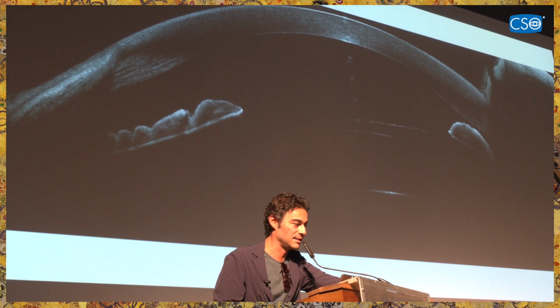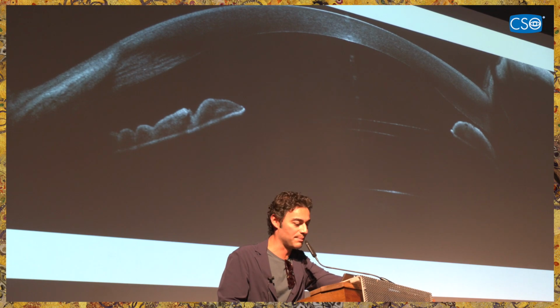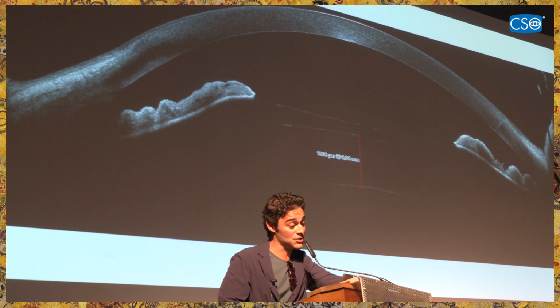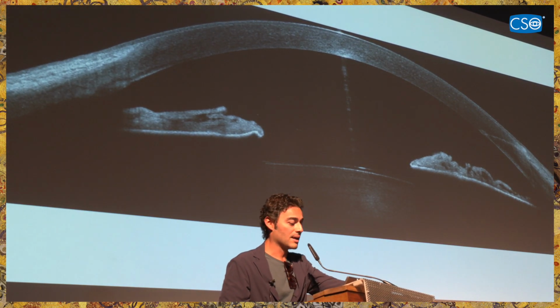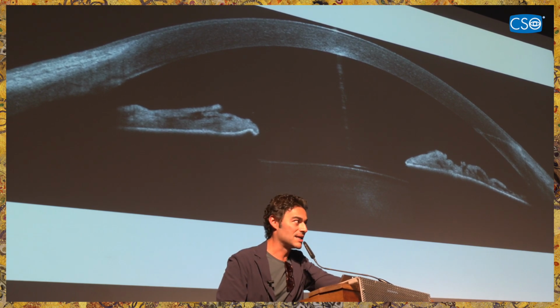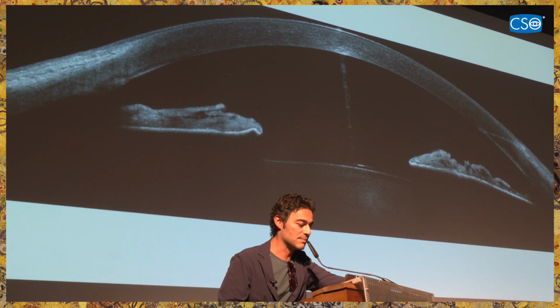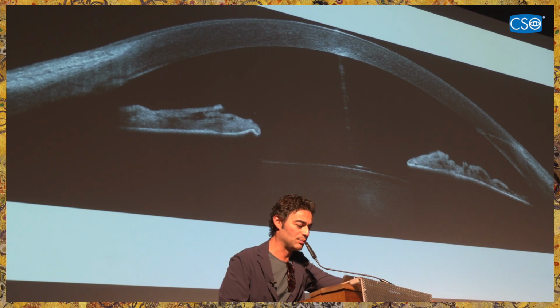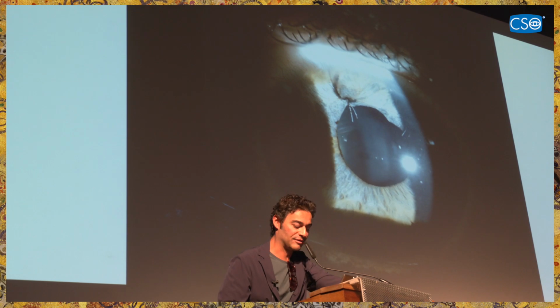So of course we decided to remove the lens and to implant a new lens, a smaller size, in one step. And this is the new lens in position. Still the vaulting is quite high, but over time it will become shallow. This is the opposite. As you can see here, the ICL is resting on the crystalline lens. Actually, this case was done on purpose because we didn't have the room to put another ICL, but there was an ectopic pupil in this patient, and in this specific case, I needed a shield in order to perform some sutures in the iris to do some pupilloplasty.